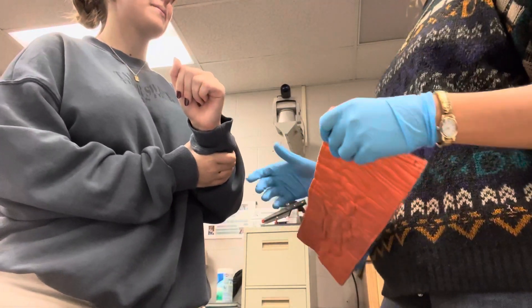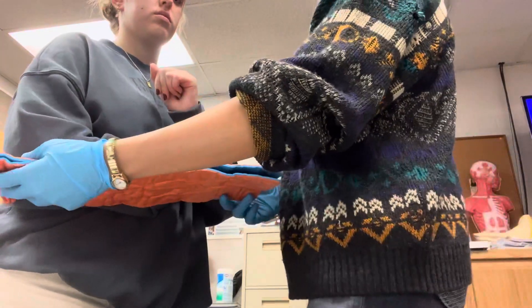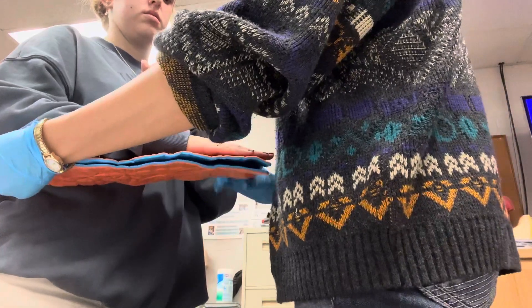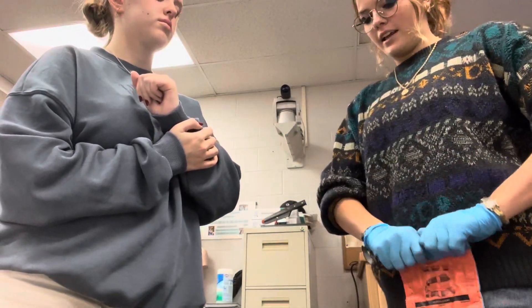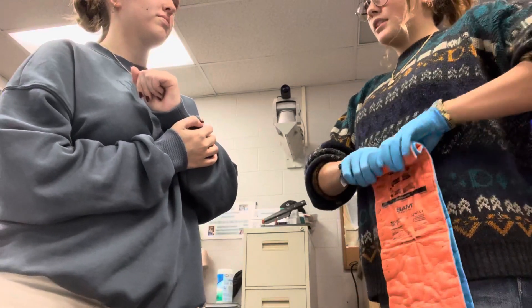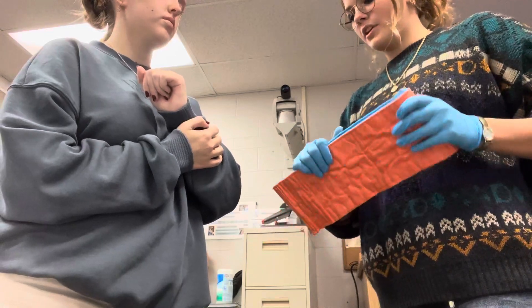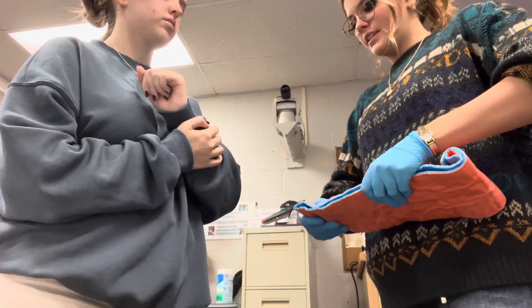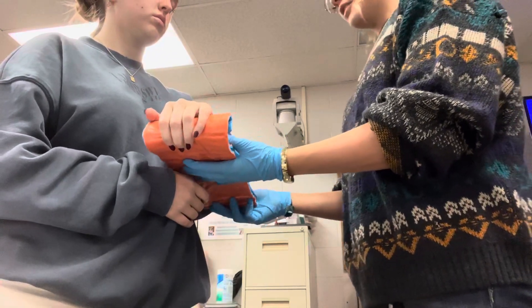I'm going to have her hold her arm in a place of comfort. Then I'm going to measure on her good arm. Can I have you hold out your arm real quick, ma'am? Okay. Then I'm going to fold it to make a handhold to comfortably hold her arm. Once I have it all measured out, I'll have her place the arm on it. Very gently. That looks good.